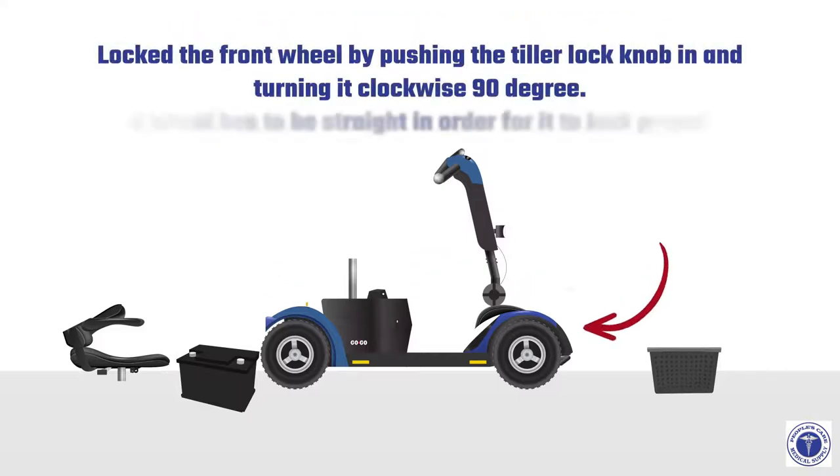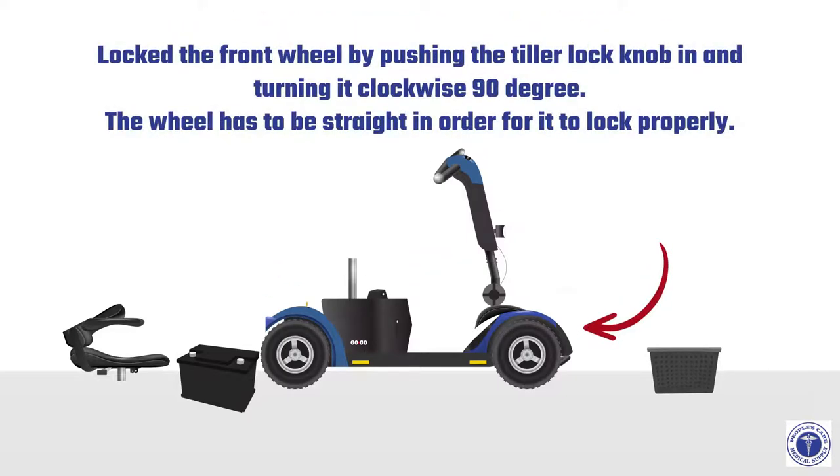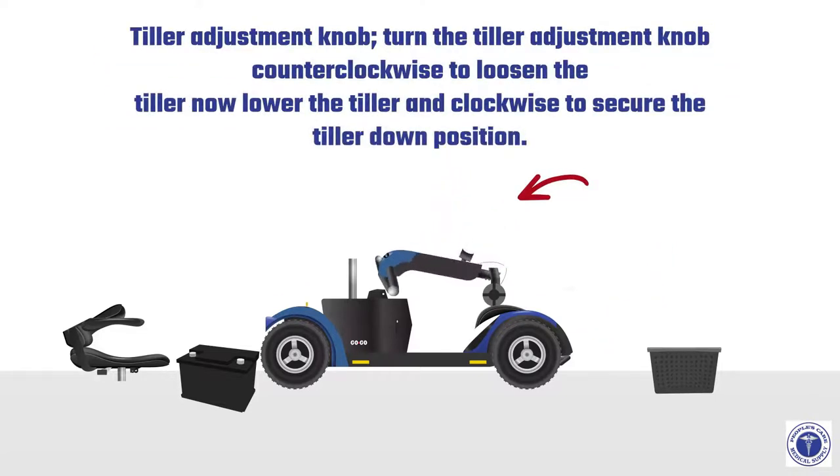Lock the front wheel by pushing the tiller lock knob in and turning it clockwise 90 degrees. The wheel must be straight in order for it to lock properly. Then turn the tiller adjustment knob counterclockwise to loosen the tiller, lower the tiller, and turn clockwise to secure it in the down position.